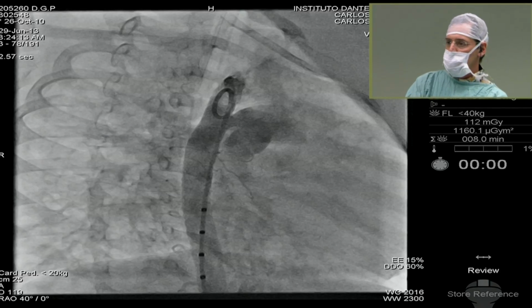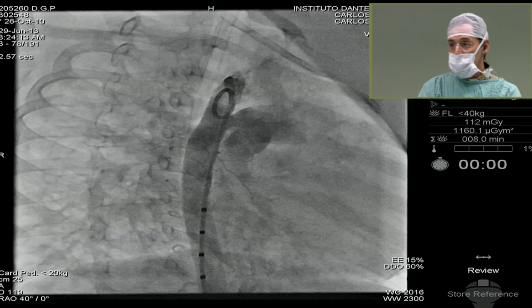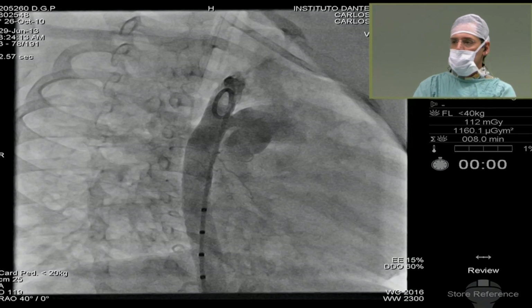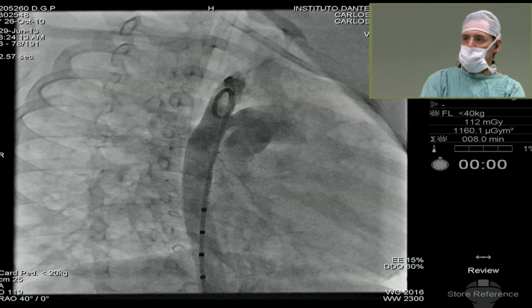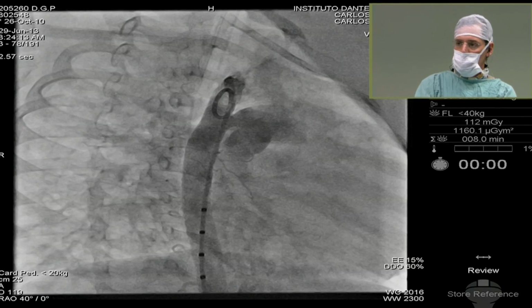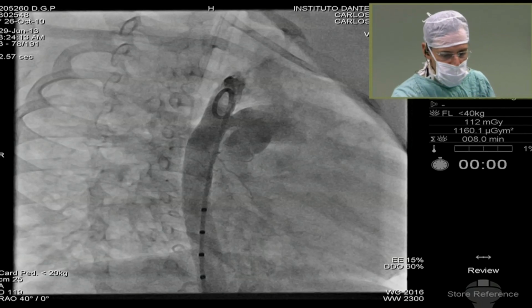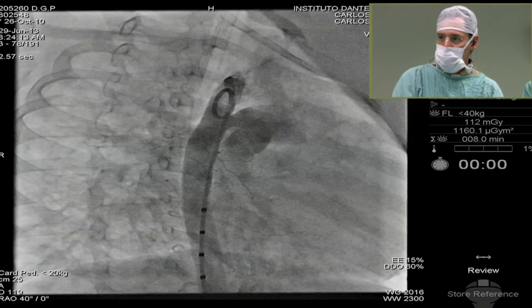The other option we have is 6 on the aortic side and then 8 on the pulmonary side, and then we would have a 13 millimeter diameter disc. So we're going to try to put the larger device in and see how it fits, but theoretically we'll change to the other device. The aortic part or disc of the device is flat, yes?